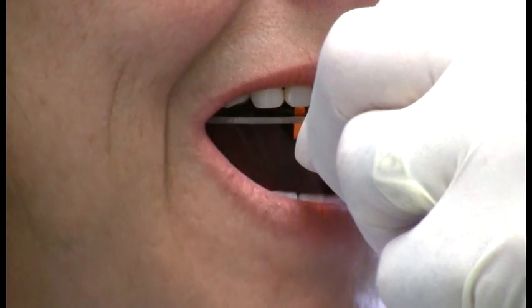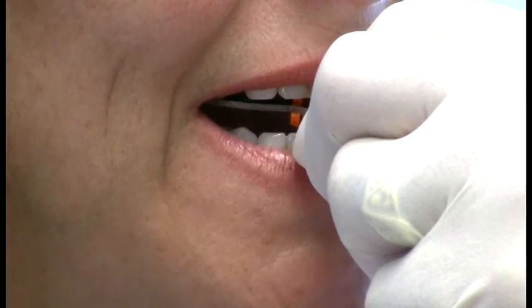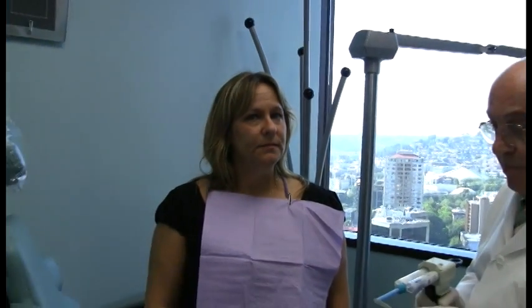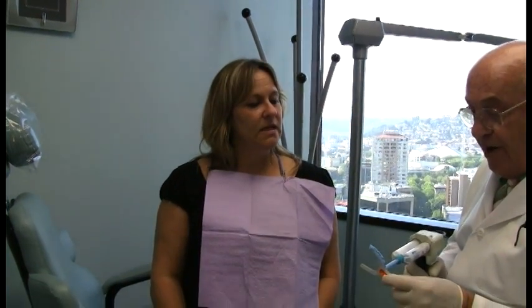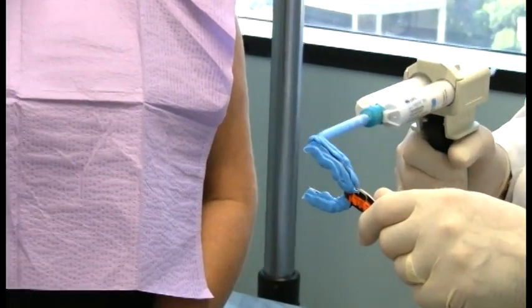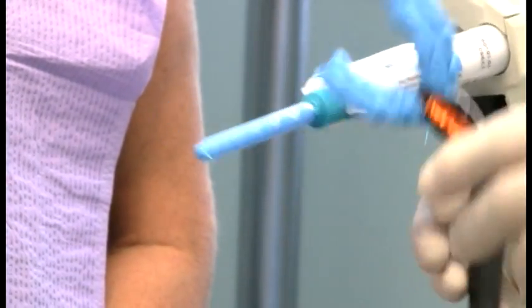Okay, now while I hold this gently against your front teeth, you only have to open it about 1/4 of an inch. Just sort of get so your jaw comfortably swings into that notch. Okay, and I'm going to be verifying that we're lined up in the center line by looking at the anterior surfaces of our incisors. And now we're ready to get the bite registration. So we're going to put the bite paste on the bite fork, but I do not cover the front area where her incisors fit in the notches, so I can have a clear view of the right-left alignment and her center line at all times when we're fitting this into place.